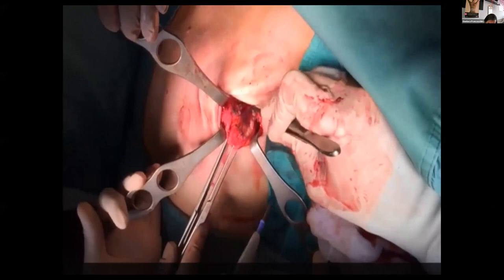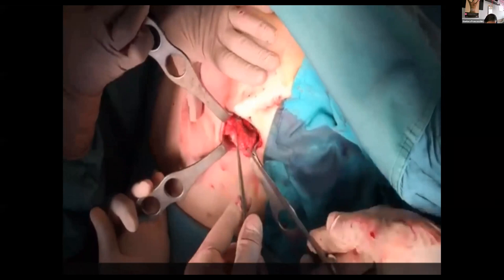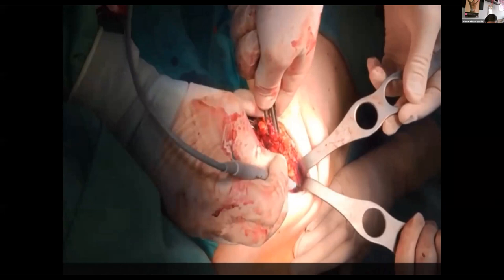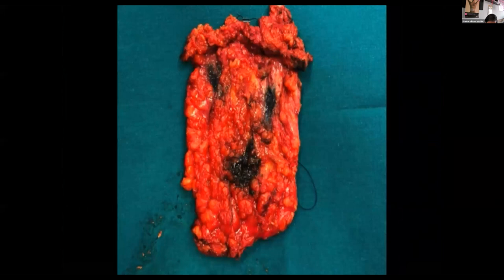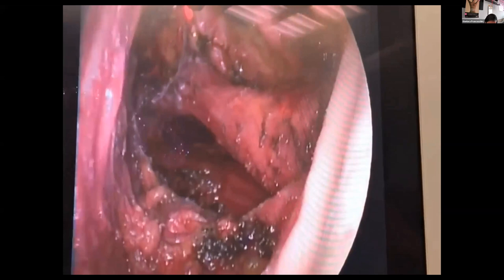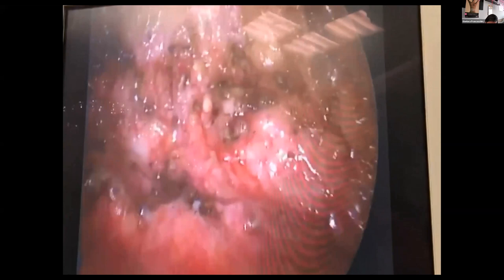After the incision, a skin flap is incrementally elevated from the glandular tissue and dissected off the breast by electrocautery. Here we can see our maneuver of blunt dissection. We use fingertips. At the end, we can see the entire gland removed. And here, after the mastectomy, we perform a systematic circumferential visual endoscopic exploration of the surgical cavity to exclude the presence of further macroscopic residues of mammary gland.